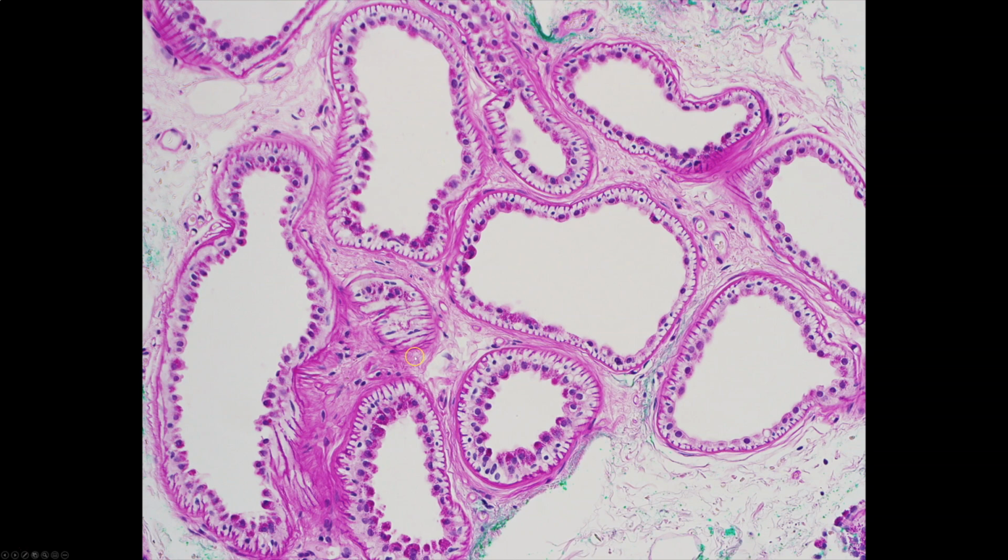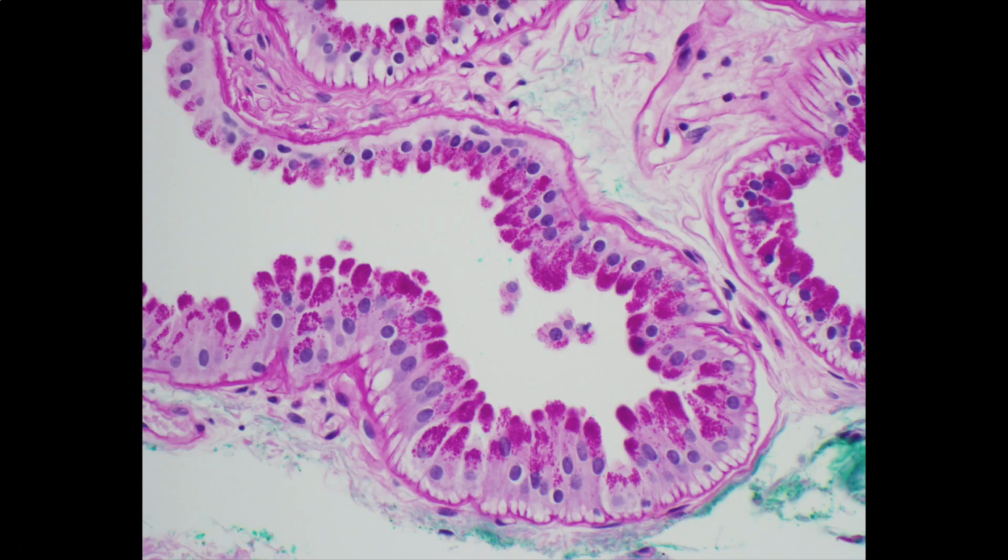So number one, the granules that I pointed out earlier, they brightly highlight with PAS. And then also look at this cool little spiky bottom here. This is the basement membrane underneath the cells, which is made of collagen type 4. And here you can see where the basement membrane kind of comes up and invaginates in between each individual cell, kind of cups around it, which gives a really cool kind of striped appearance. I just thought it was quite amazing and beautiful.